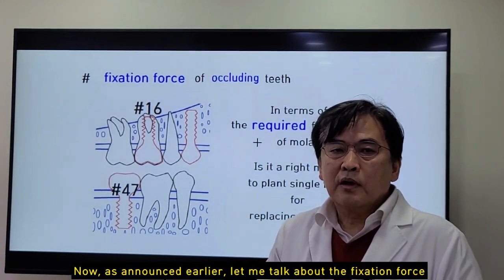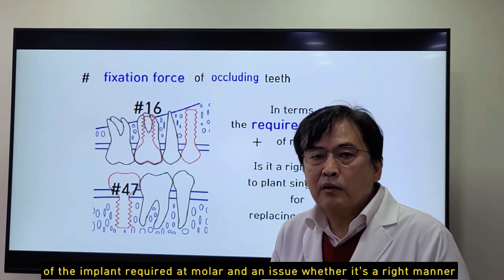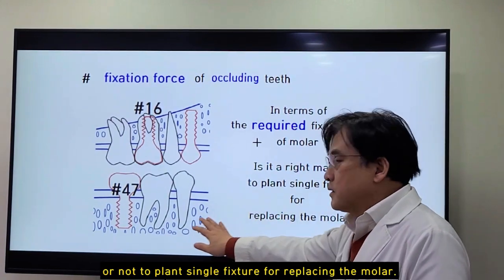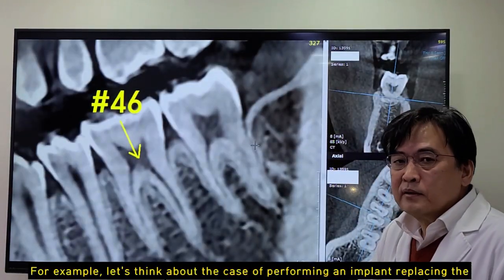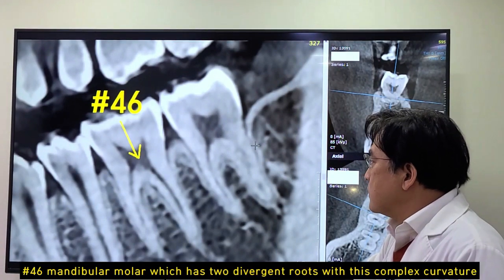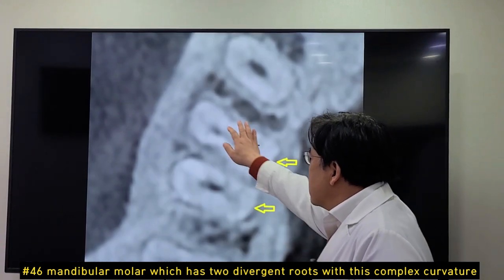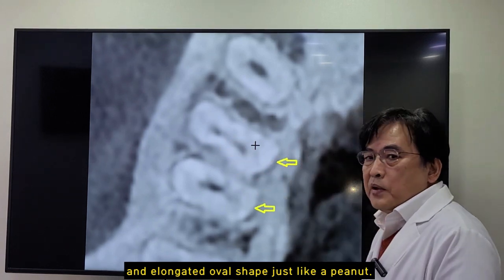Now, as announced earlier, let me talk about the fixation force of an implant required at a molar, and the issue of whether it's the right method to plant a single fixture for replacing the molar. For example, let's think about the case of performing an implant replacing the 46 mandible molar, which has two divergent roots, with this complex curvature and elongated oval shape, just like a peanut.